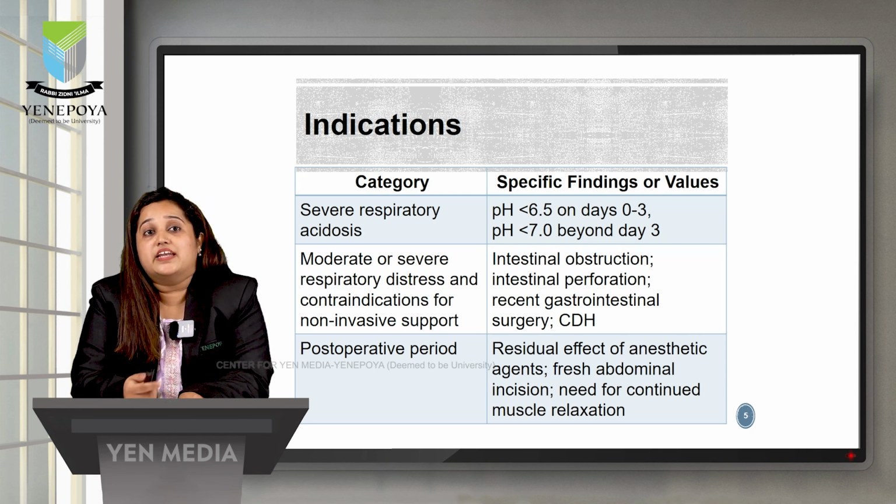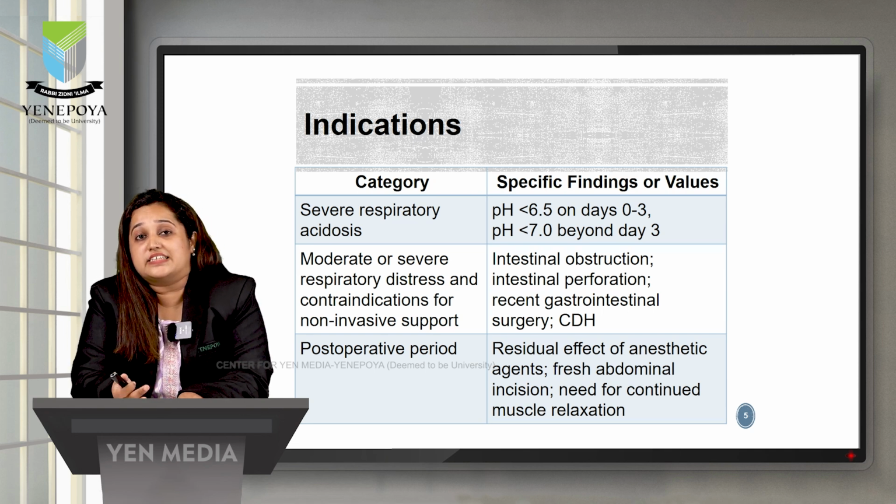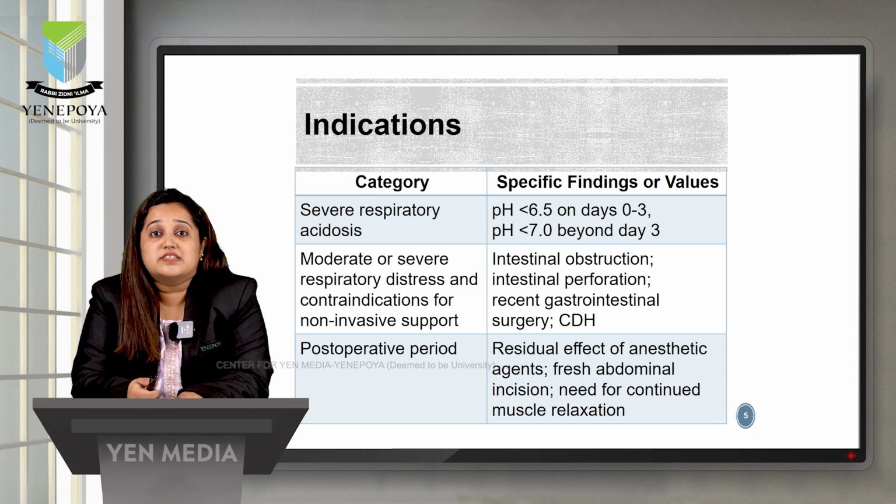Apart from this, in any post-operative period where the baby has come after a surgery, there is a residual effect of the anesthetic agent, or the baby still requires some muscle relaxation, in such cases we go for invasive mechanical ventilation.